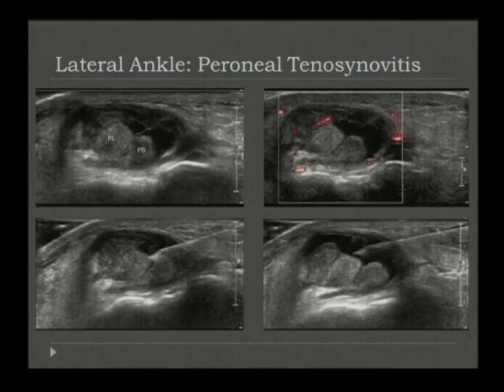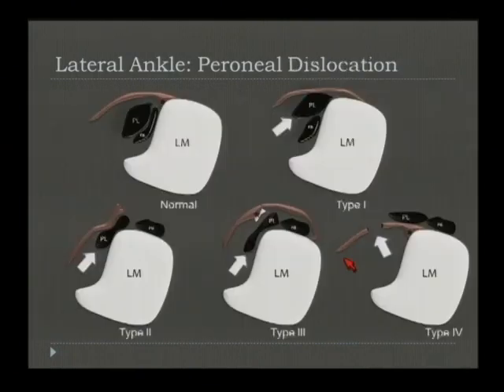Again, able to not only diagnose some of these entities, but also treat. Here's a case of tenosynovitis involving the peroneal tendons. Again, marked distension of the tendon sheath, a lot of debris and thickening, as well as some hyperemia. Easy to place our needles. Again, I come from a transverse plane, place our needle inside, and then administer. Typically, we give a cocktail of anesthetic and corticosteroid.